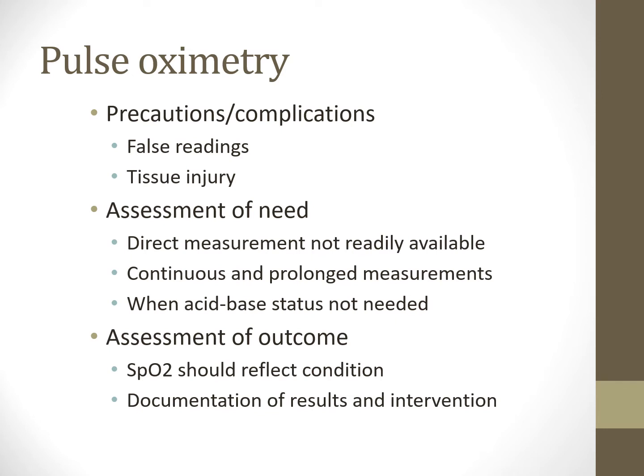Well, then we can use pulse oximetry. There was an article by Respiratory Care Journal that came out a couple years ago. I want to say it's probably around 2016 in Respiratory Care Journal that looked at pulse oximetry and accuracy, and one of the patient populations that it was most inaccurate in was COPD patients, which is the exact population you would want pulse oximetry for, so they can monitor their saturations when they're ambulating and when they're walking around the block with their little dog, right?